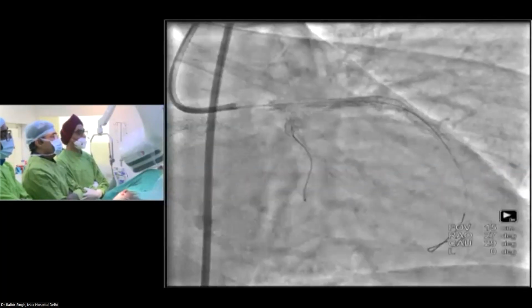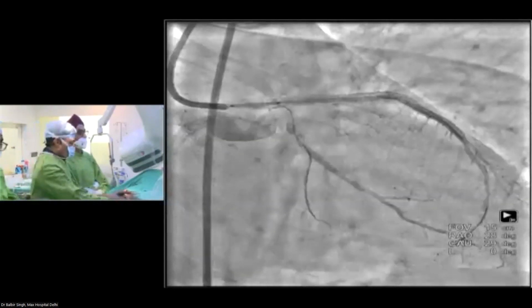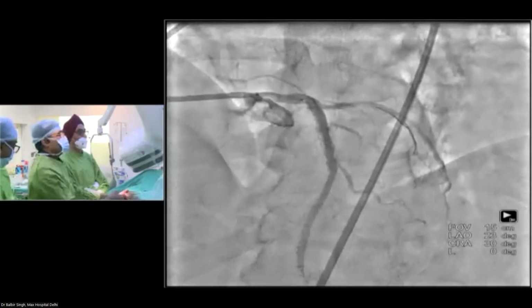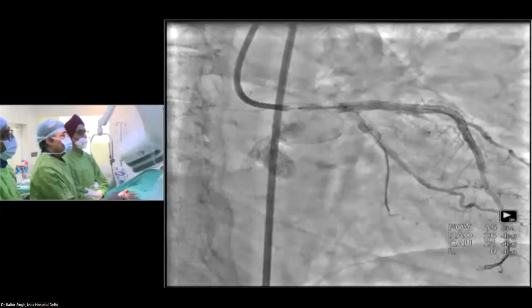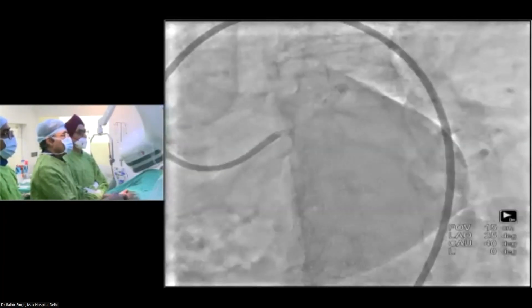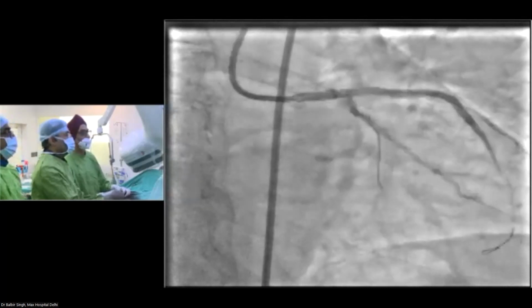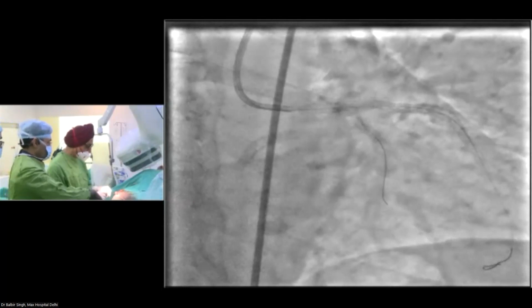Next. And then we had to cover up the proximal part of the left main, so we got another stent. Next. So this is a 4/15 Xience. We have to avoid the circumflex this time. Next. And we have to check the ostium on the LAO cranial, which is perfect. Next. And we deployed this stent. Next. So now we have to take a picture. Okay, that looks good. So we have a jailed circumflex wire, which I'll remove. We'll do a final POT and then imaging. Would you agree with that?